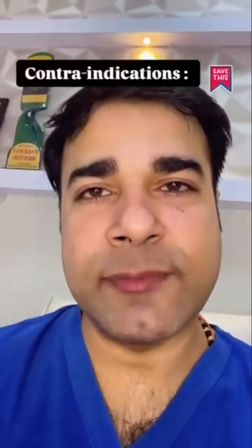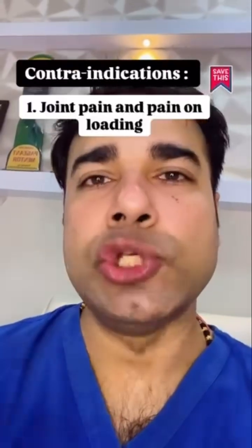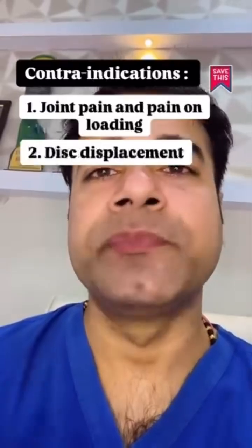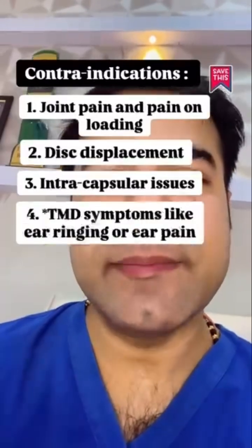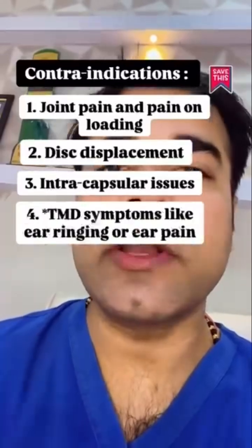Contraindications for this type of appliance are as follows: joint pain and pain on loading, disc displacement, intracapsular issues, and TMD symptoms like ear ringing or ear pain.